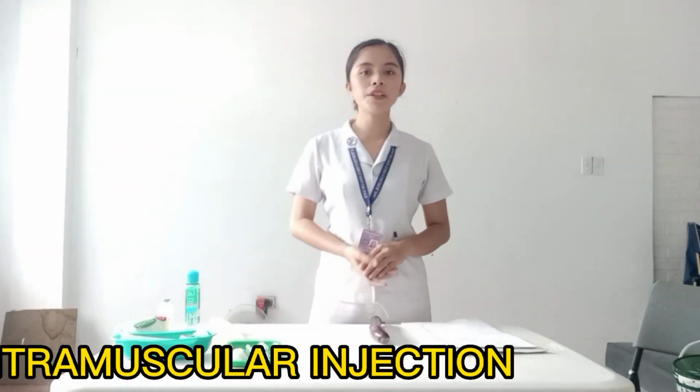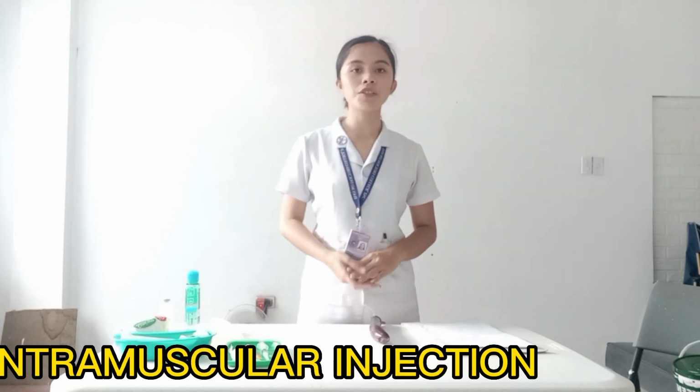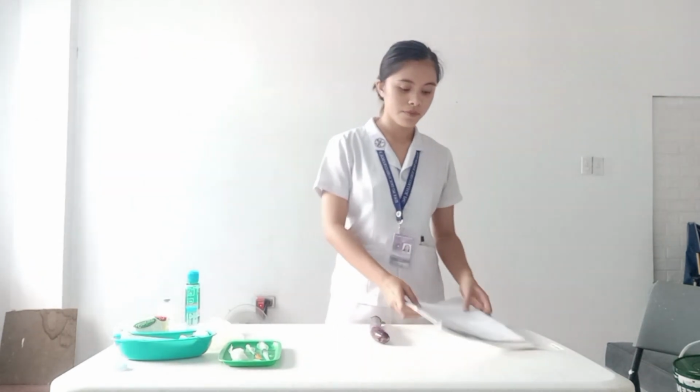So I will now proceed in administering intramuscular injections. The first thing to do is to check the MAR because the chart of the patient is more reliable than the medication ticket. Then I have to check the label on the medication carefully against the MAR to make sure that the correct medication is being prepared.